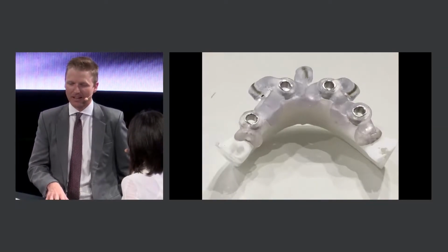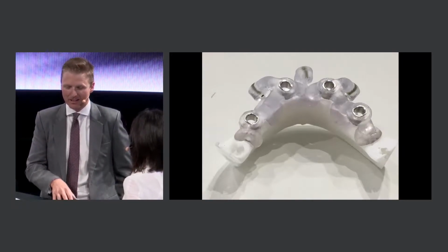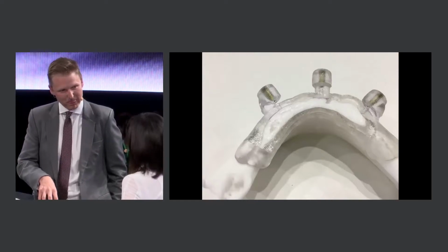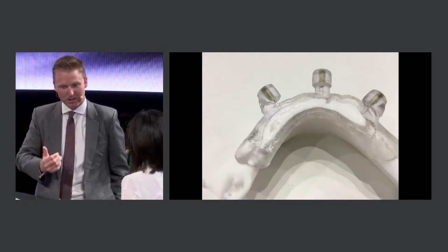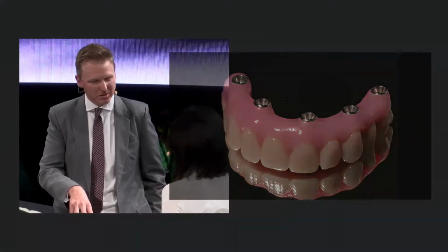And how we might capture that in an implant planning sense, if we're looking at implants, is often something we do in combination with a CT scan and a radiographic guide. To step through the clinical situation, we want to take that intraoral scan to register the shape and the size of the tissues, but we also want to see where the bone is in relation to that. And the best way I've found to do that of late is to make up a little occlusal rim, an actual analog occlusal rim. Yep.